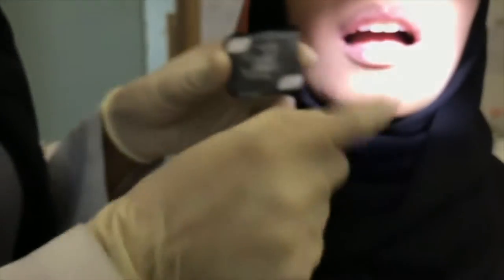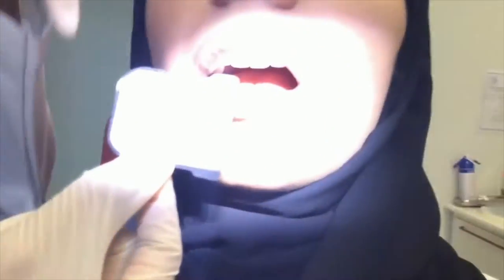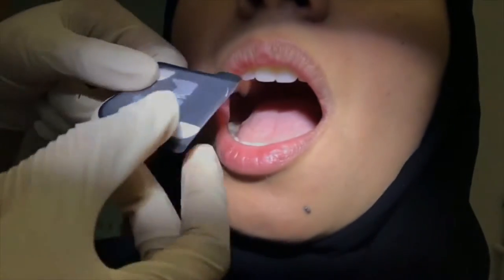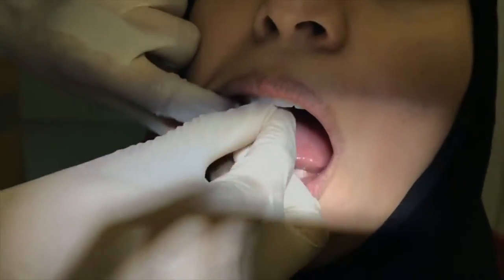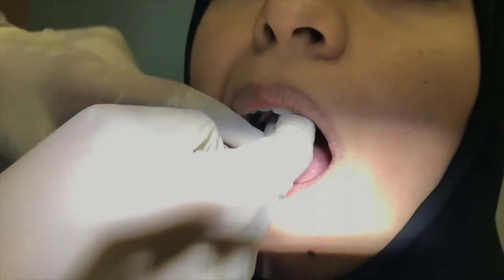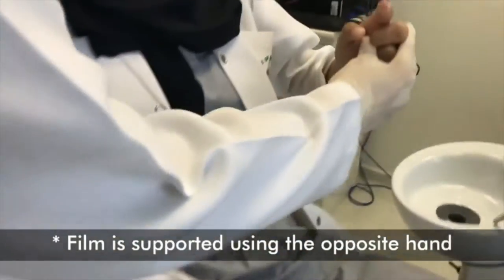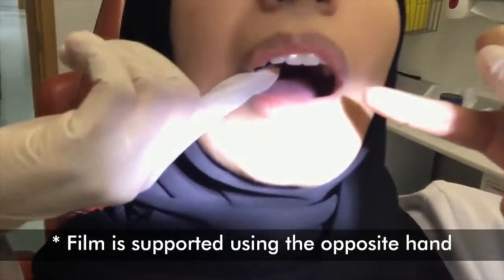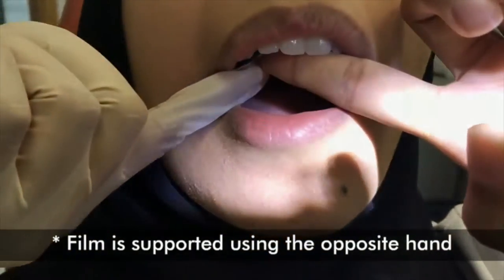For posterior teeth, the film should be positioned horizontally. The marker or dot should be placed 2 mm beyond the occlusal edges. Ask the patient to gently support the film using the index finger.